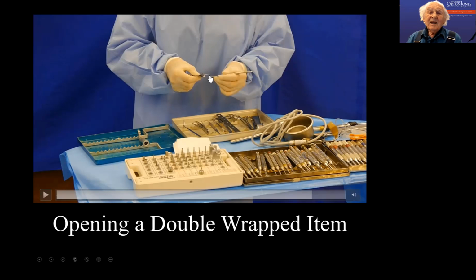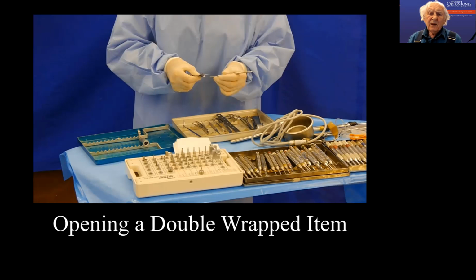Now, in our instrument pack, we have a scalpel and the scissors and the periosteal elevator, and also a scalpel blade in its packet. So it's already in the pack, ready for the blade to be put onto the handle.